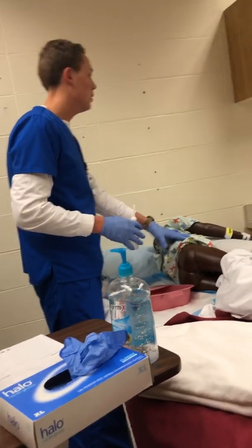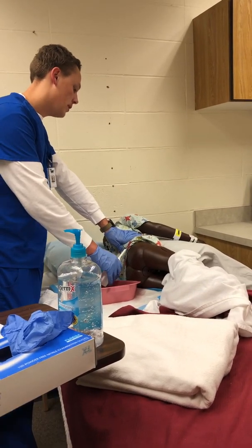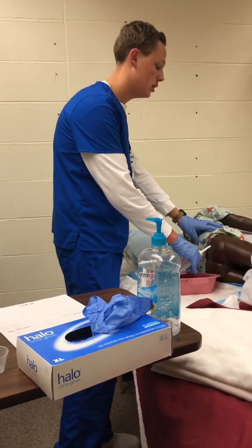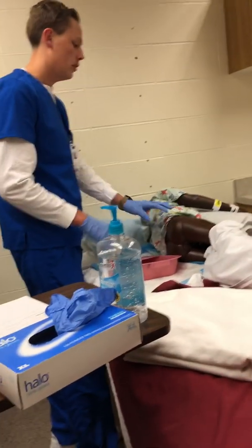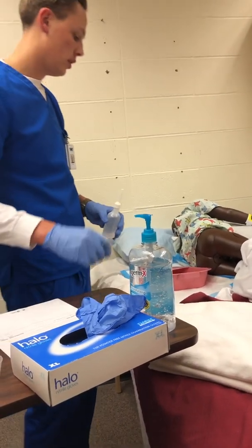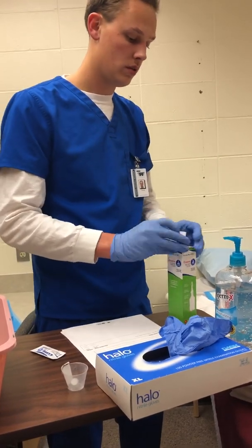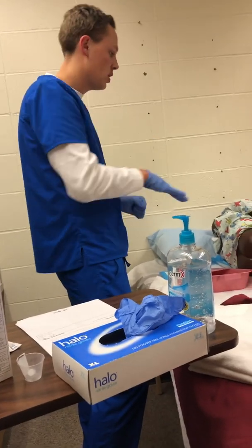So I'd have them inhale, hold it in, and then on the exhale I would insert the enema, and then slowly squeeze in the fluid, and have them hold it and retain it for as long as possible. I would insert it from 3 to 4 inches, and then have them retain it. I would then pull out. I would dispose of this per facility policy. And then I would leave the patient in the left Sims.